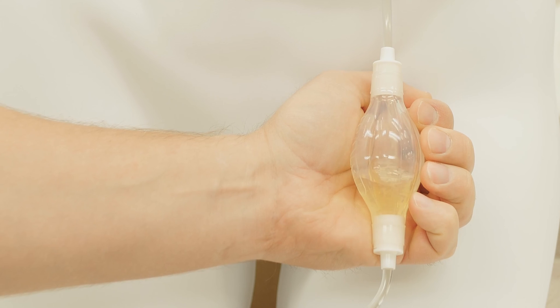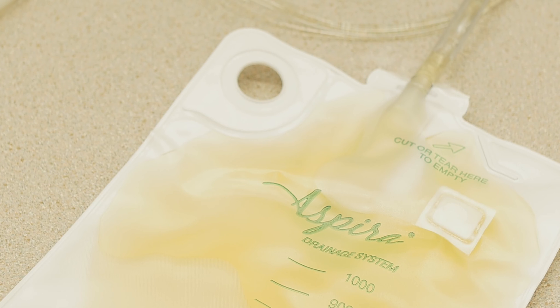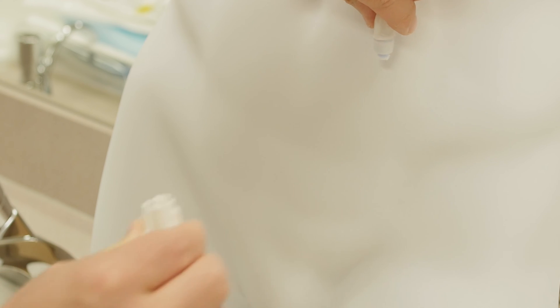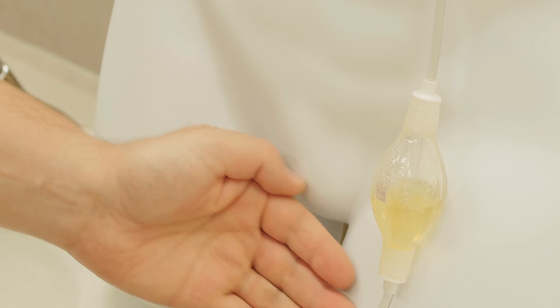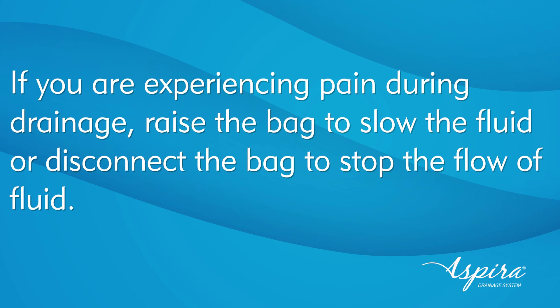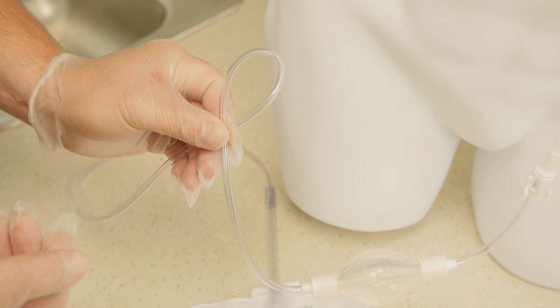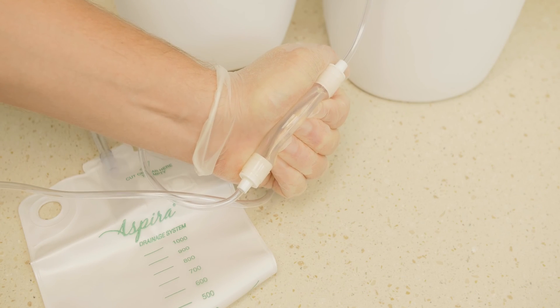Gently squeeze the pump one time. It will slowly re-expand as fluid fills the pump. Allow the fluid to drain until the bag is full or the fluid stops flowing. If the pump does not re-expand, or re-expands but does not fill with fluid, check the connection and gently squeeze the pump again. If this does not work, try again with a new drainage bag. If a new drainage bag does not start to flow, call your healthcare provider. If you are experiencing pain during drainage, raise the bag to slow the fluid or disconnect the bag to stop the flow. To restart the flow, reconnect the bag and squeeze the pump. Note that a kink or loop in the line can stop the flow early — if this occurs, remove the kink or loop and squeeze the pump again.